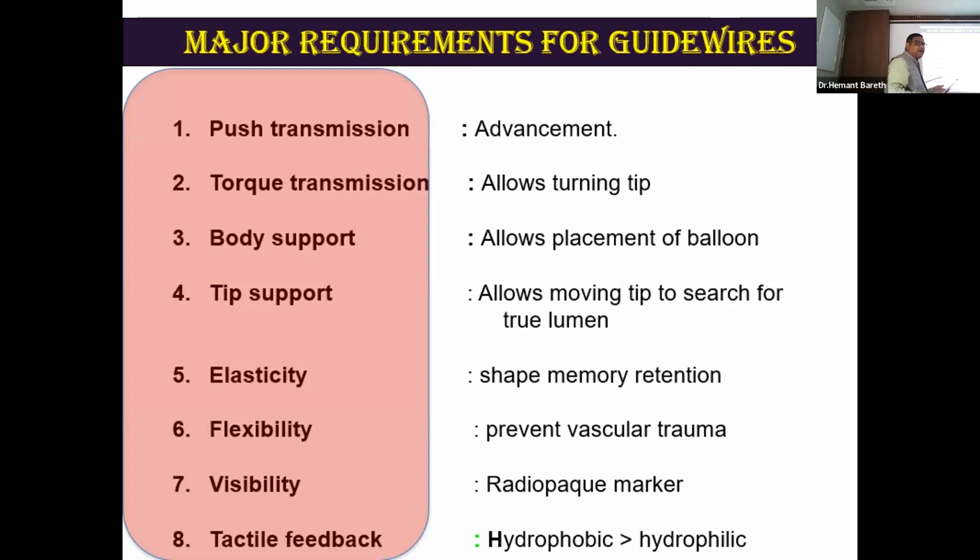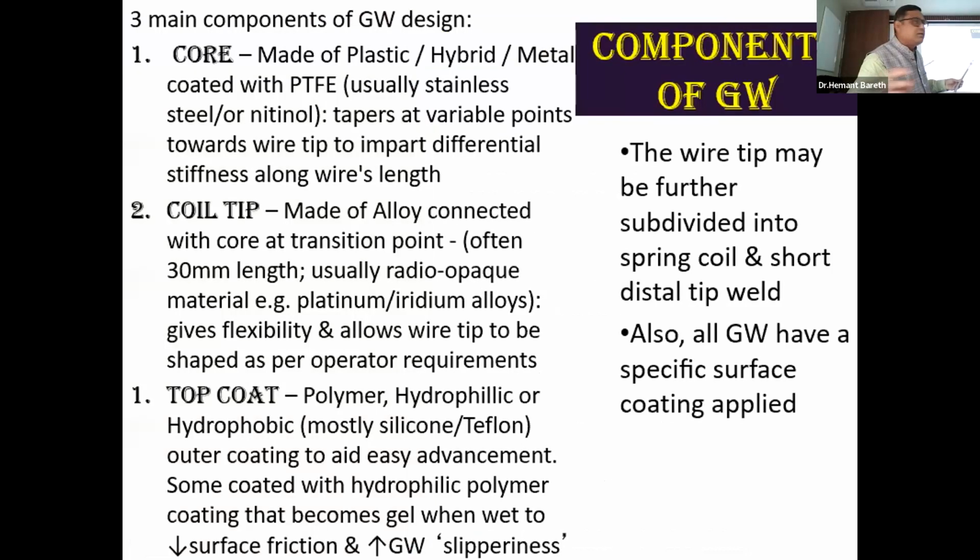Everybody understands visibility because you need to know where the wire is going. And tactile feedback, I already discussed with you. Hydrophobic wire or non-coated wires have the most tactile feel versus hydrophilic or polymer coated wire, which don't have a tactile feel. So everything good so far?